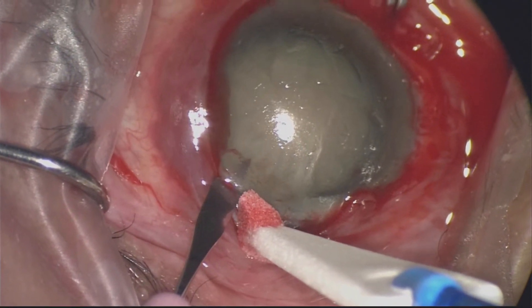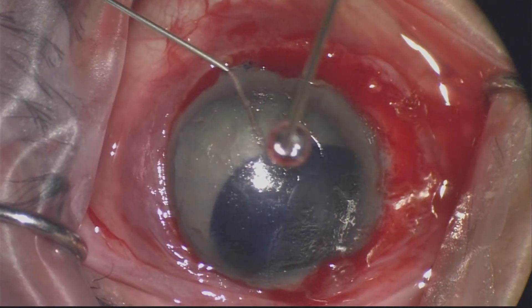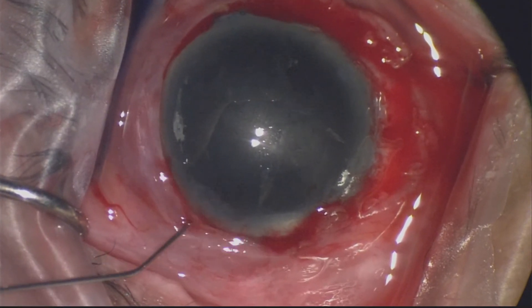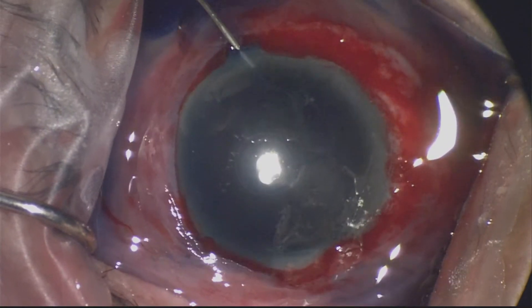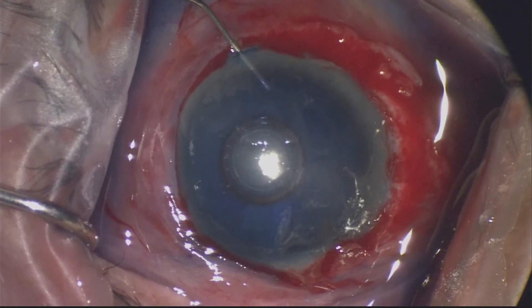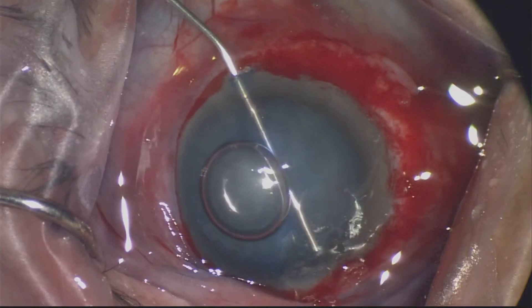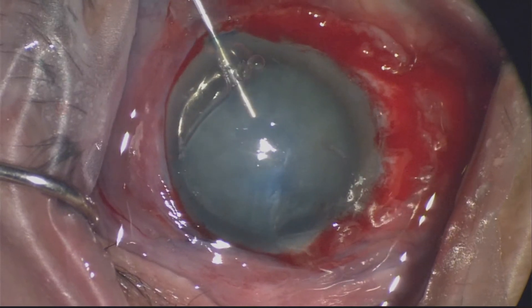Here I'm doing a paracentesis on both sides, as I often use bimanual in these instances. This patient has a very dense white cataract, which can be very unpredictable, especially in this kind of pathology, so you want to use all tools available to you. I'm using Vision Blue, just trying to get a feel for the behaviour of the eye — whether it's a shallow AC or whether there's posterior pressure. Then I'm using Viscoat to protect the corneal undersurface.